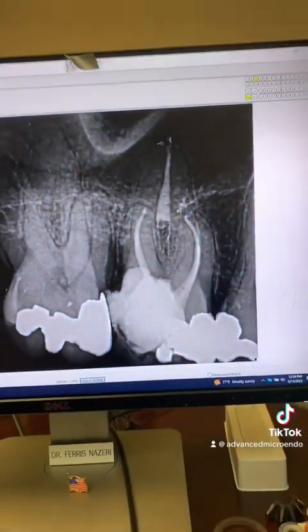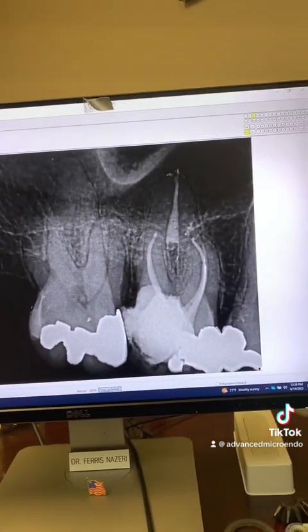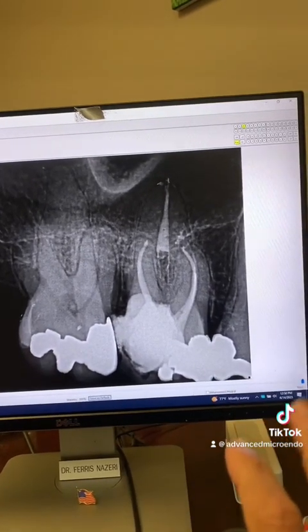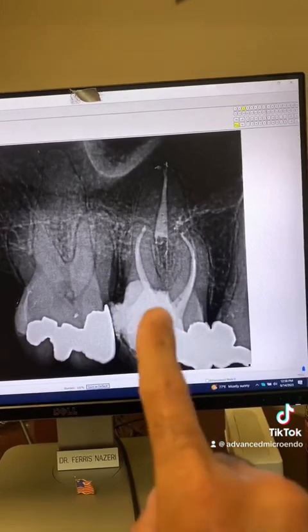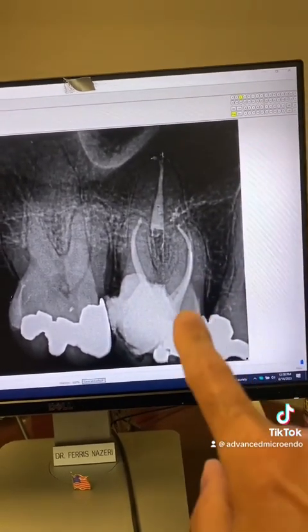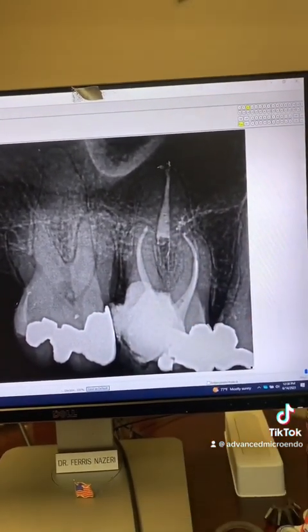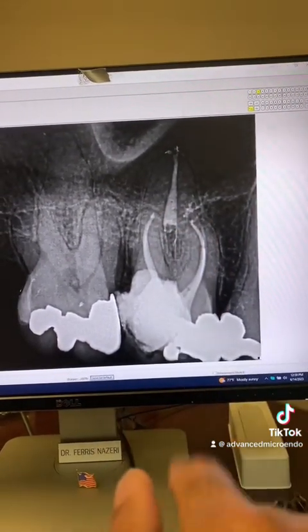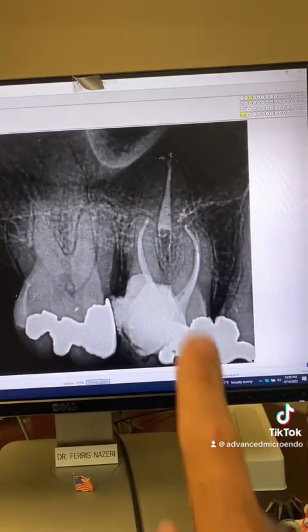And here's the post-op. So take a look. Remove the decay, rebuild the missing walls there. As I said, this tooth will need a crown lengthening. Patient and her dentist are well aware. We IV sedated her and did this, remove the decay, rebuild the missing walls. And take a look, 4 canal systems, MB1, MB2, distal buccal and palatal. I know this dentist, he likes to put posts in teeth, so I left post space for him in the palatal canal, as you can see right there, and temporized the tooth.